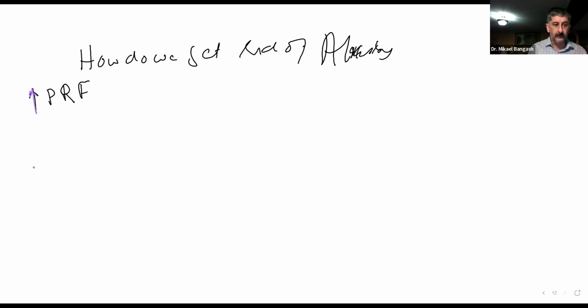But that increasing of PRF, what is that going to lead to? That's going to lead to an increase in your Nyquist limit. Did you guys get that?